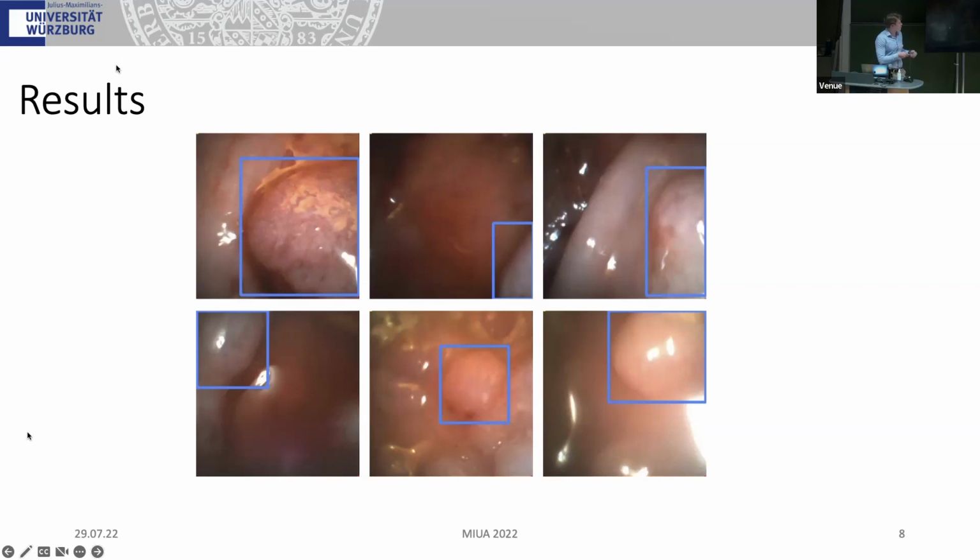So you had to deal with that and sort them out, or disable the system right there. And then you have other parts where there's enough air in the colon, and then you can see clear pictures like those, clear in the resolution, and then polyps can really be detected by the system. And then you have the whole setup giving the endoscopist the signal that he can now switch his camera, go to the site, and cut out the polyps.